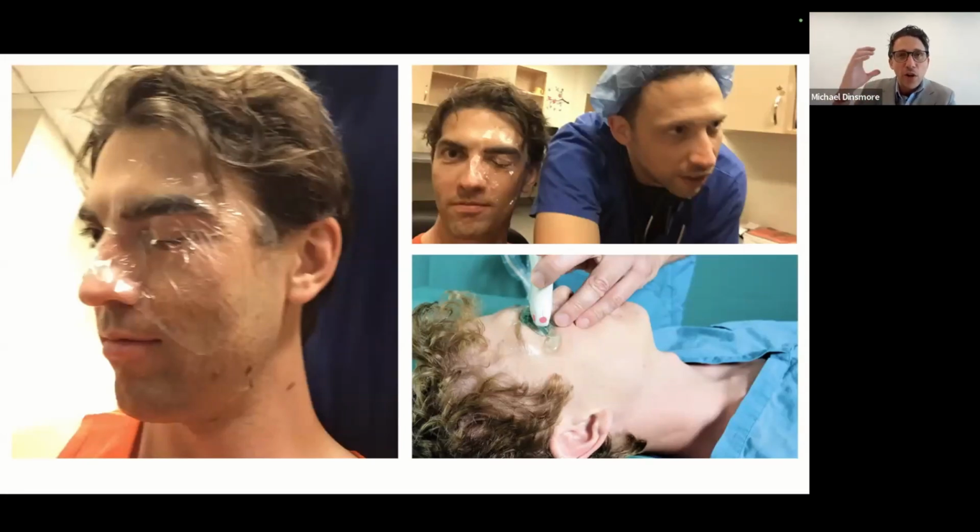And then you want to use a lot of gel because you don't want to put pressure on the patient's eye. It's a little bit uncomfortable if you're putting a lot of pressure, especially beginner ultrasonographers. If they don't anchor their hands, they're going to put a lot of pressure on the eyes. It's going to be uncomfortable for the patient. It won't cause any damage, but it's just uncomfortable.